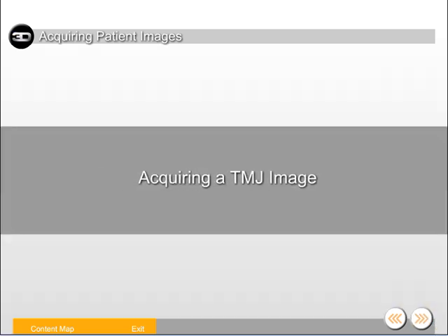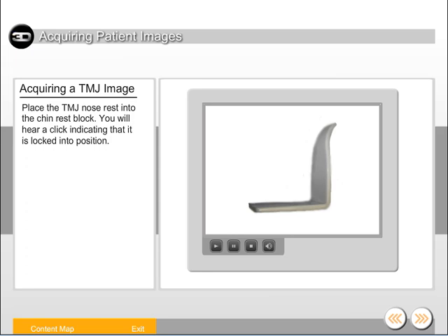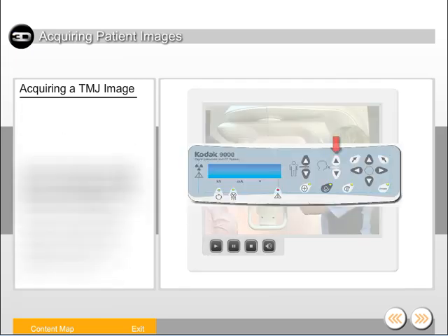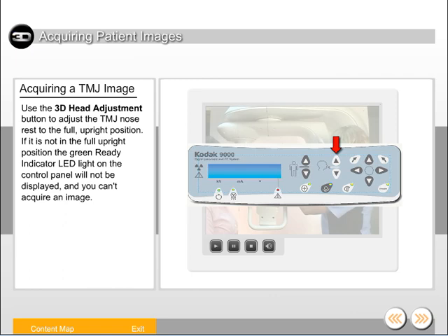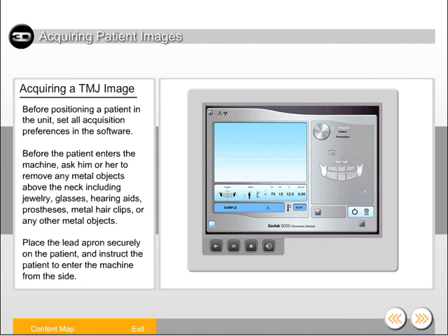Let's take a look at positioning a patient to acquire a TMJ image. Place the TMJ nose rest into the chin rest block — you'll hear a click indicating that it's locked into position. Use the 3D head adjustment button to adjust the TMJ nose rest to the full upright position. If it's not in the full upright position, the green ready indicator LED light on the control panel will not be displayed and you can't acquire an image. Use the height adjustment button to adjust the machine slightly higher than the height of the patient. Before positioning a patient in the unit, set all acquisition preferences in the software.